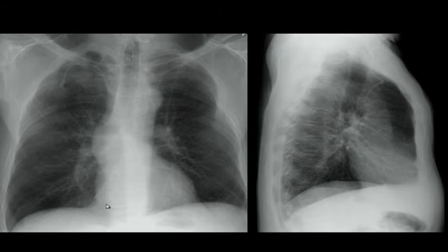This aorta. What did you say about the line? It's coming over the contralateral side. So is that normal? No. Which vessel is the line originally placed in? Looks like it was originally placed in the right IJ.